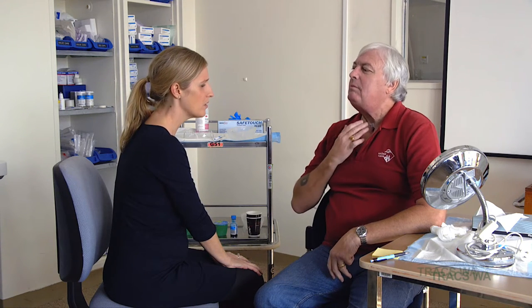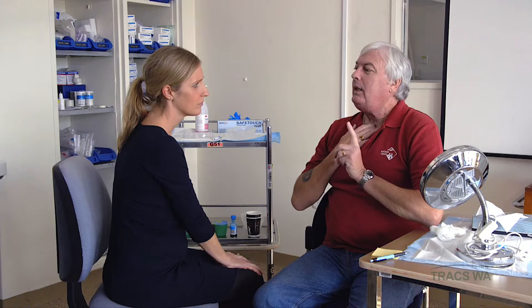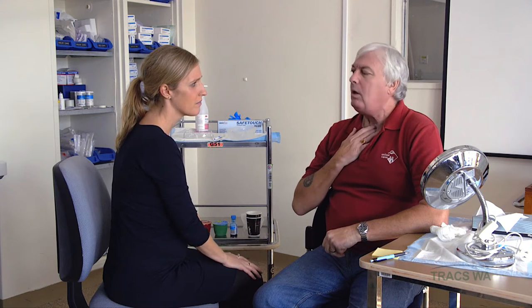So Matt, I understand your voice has stopped working. Can I hear what happens when you go to voice? How long has it been like that for? A day, so just since yesterday. Okay. And did it deteriorate gradually? All of a sudden. Okay.